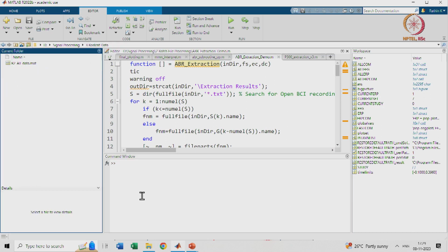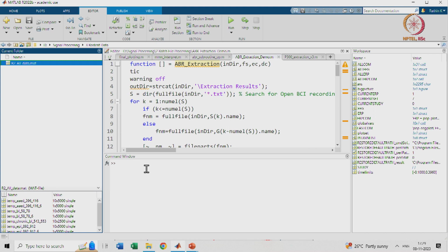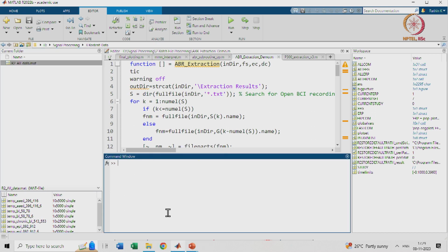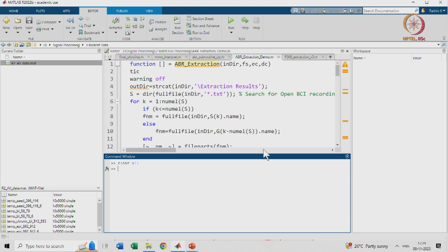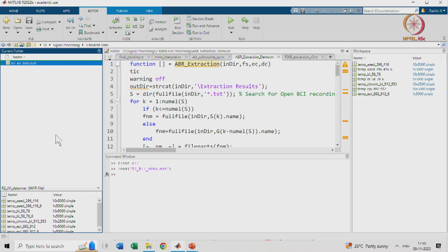This is the rodent data. I have put in all the data. Again, as I mentioned, it is acquired using known systems. Now this is pure MATLAB based analysis. After getting the data, you don't require EEGLAB for this processing; we'll be using the Signal Analyzer app in MATLAB. So I have cleared the other things. I just want to put in the data that I have, so I will be loading it.